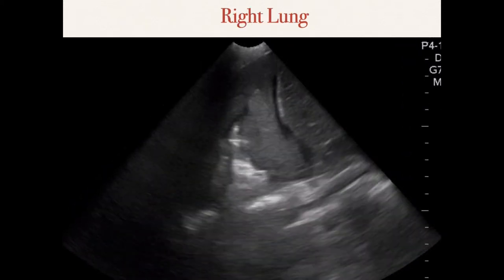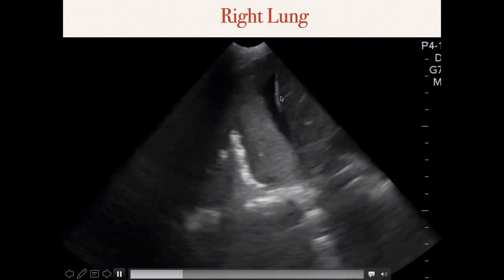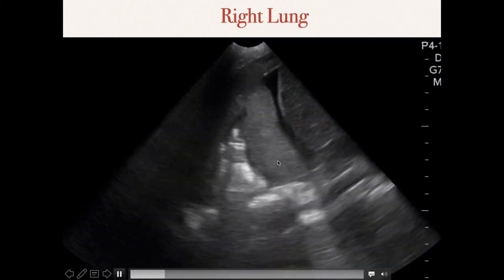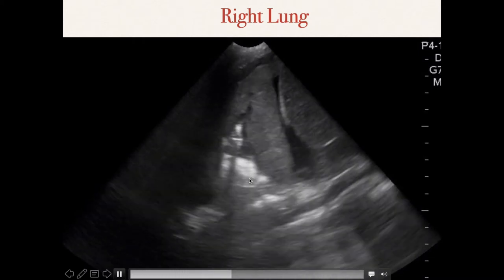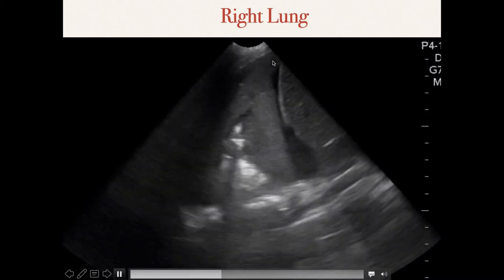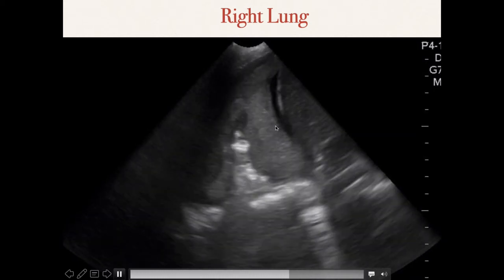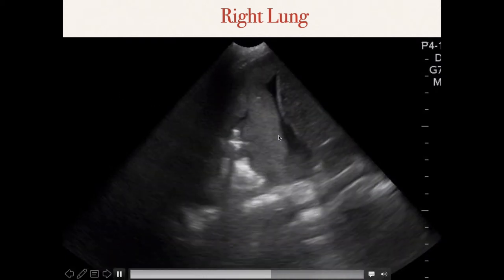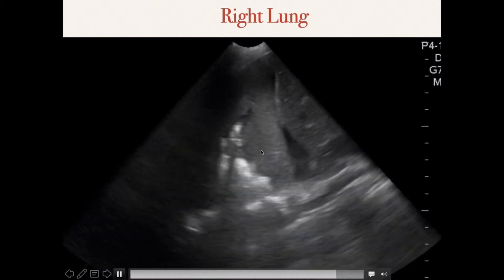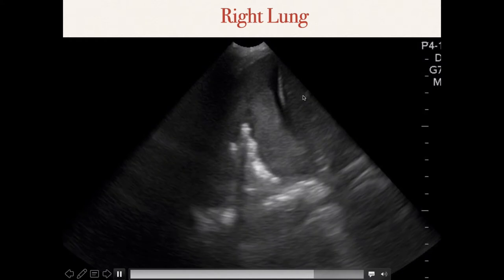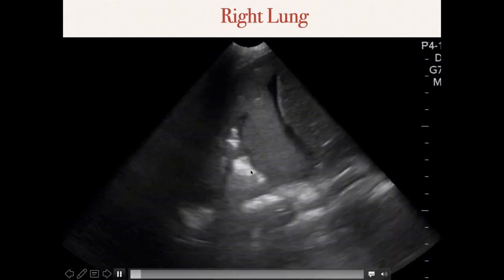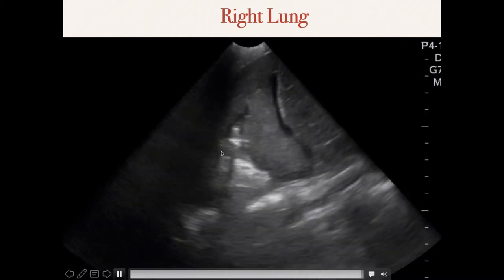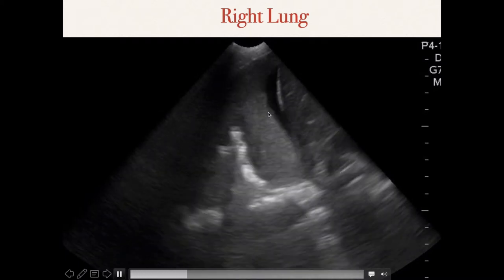Here's the right lung at the right lung base - I can see liver and diaphragm. We have lung tissue quivering, trying to breathe, with hyperechoic stuff inside and anechoic pleural fluid around it. Most likely, with a patient who has cough and fever, this is pneumonia - pus filling up the lung. When pus fills the lung, it tends to look like a solid organ similar to the liver, with hyperechoic portions within it. That's air trapped inside the pus-filled lung. This is what we call a peripneumonic effusion in the setting of pneumonia.